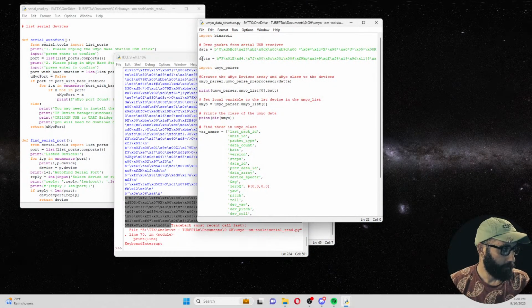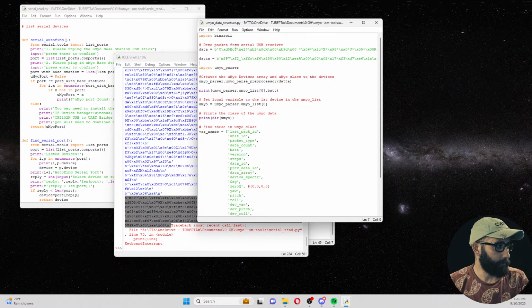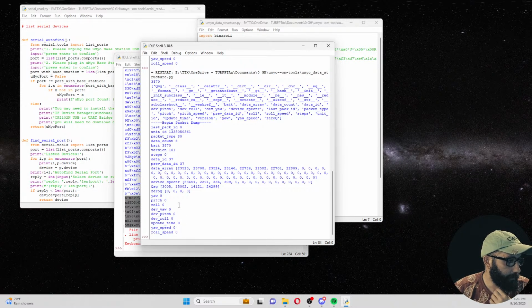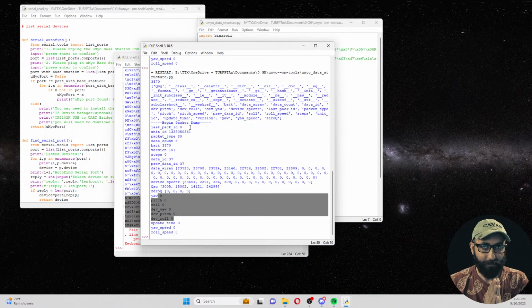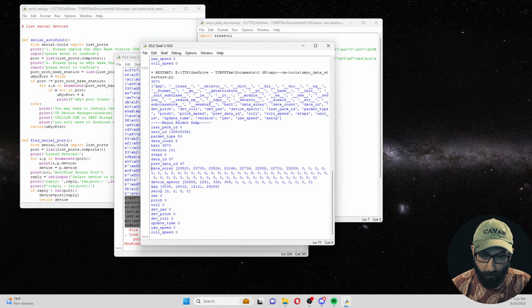Perfect. Select COM port 6 was 1, and shaking the crap out of this and hit C. Okay. So there definitely should be some, hopefully, gyroscopic data in this. So now I will change and paste the output from the serial here and run it. Okay, so maybe we might need to turn on the gyroscopic data. That's my guess, because I did move it around. But I haven't read the complete documentation. Okay, so we have these 8. So I'm going to pull up the specs here.